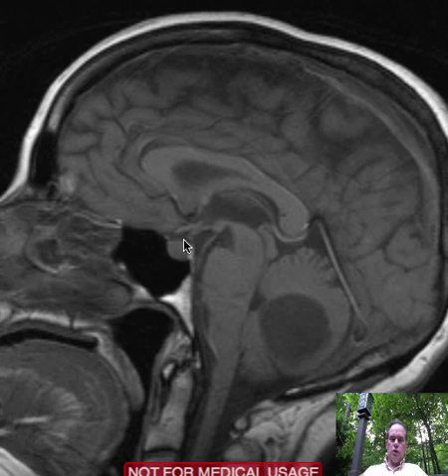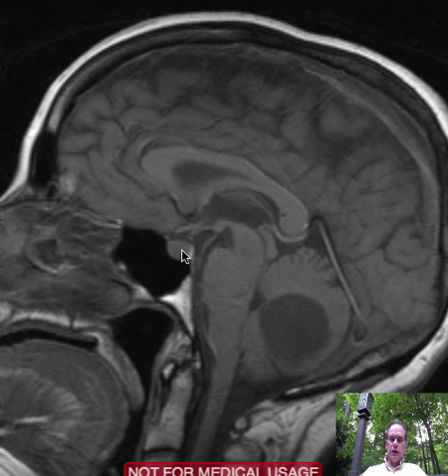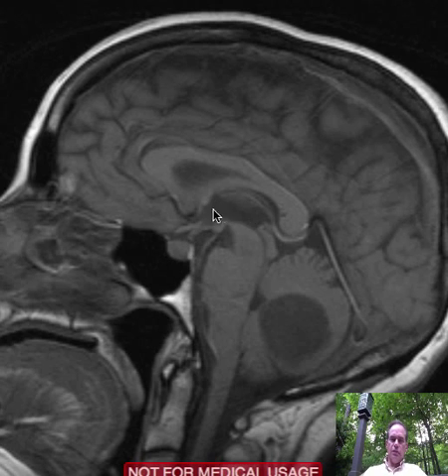We'll look first here in this area. What is this structure right here? It's a sella turcica containing the pituitary gland. And here is the pituitary infundibulum, which leads from the hypothalamus — the hypothalamus being located in the walls of the third ventricle, this being the third ventricle.